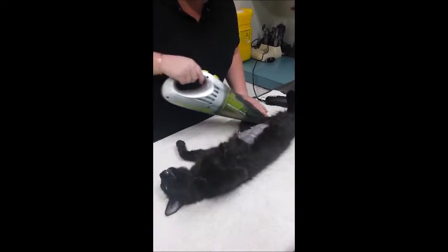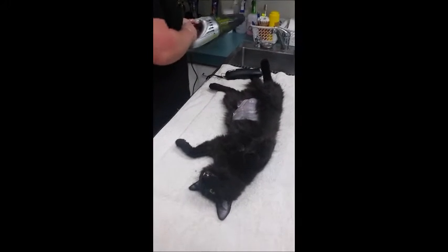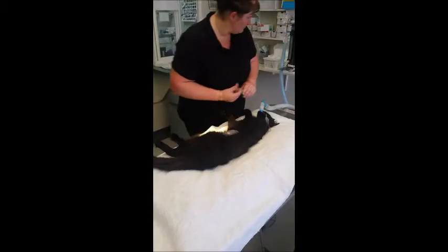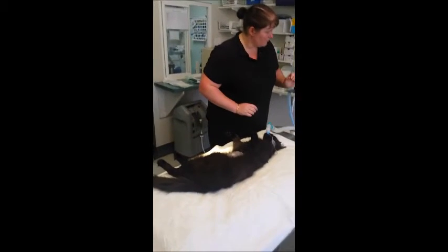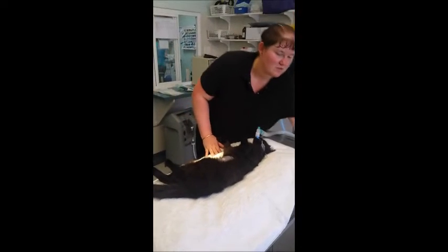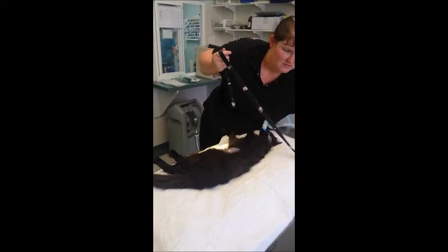The cat has its endotracheal tube placed before moving to theatre. I then proceed to connect the cat to the anaesthetic machine and set the oxygen flow rate and gas flow rate, ensuring it is all connected correctly to the endotracheal tube.